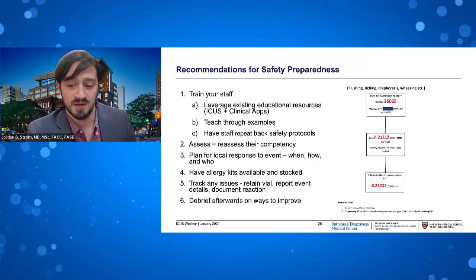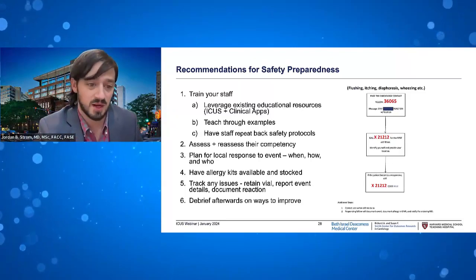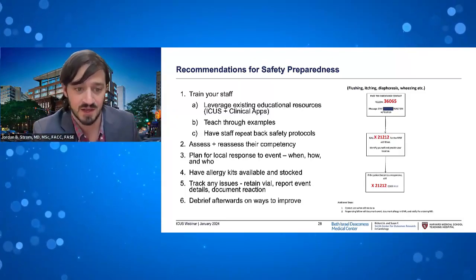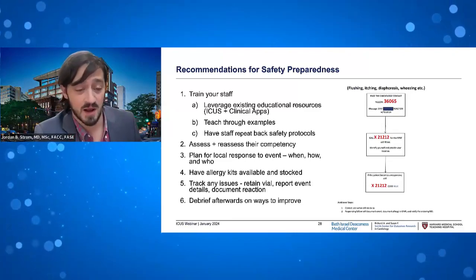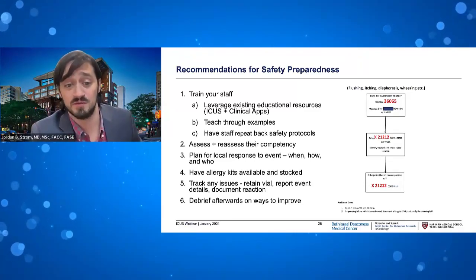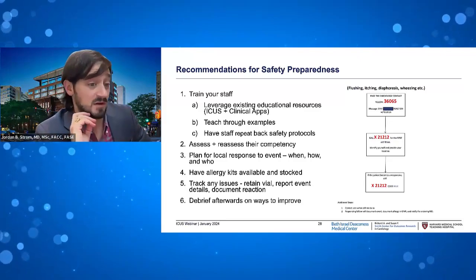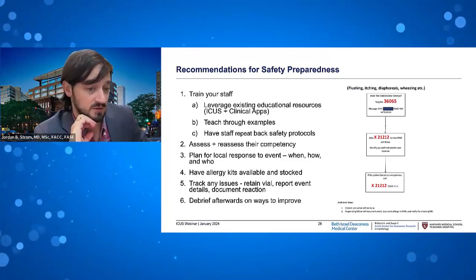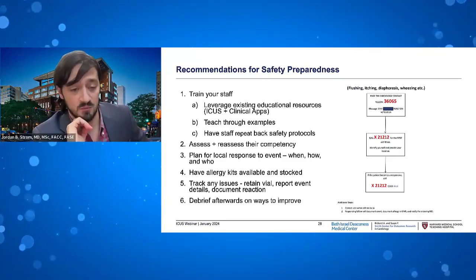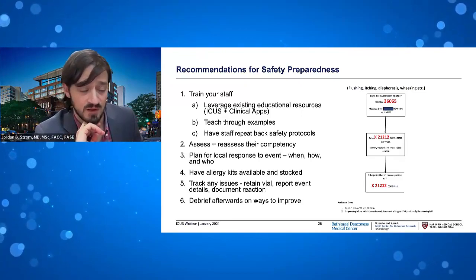And so if the patient became unresponsive, we would call code blue. But ultimately, that response mechanism in training and drilling it into the fellows, if you're not going to be there, if you have somebody covering, make sure they're covering the bubble pager and talk to them about what their expectations are, has worked out very well. And we have had reactions at our institution because we do use a lot of contrast. And those have gone well, and the patients have been safe, and ultimately a good outcome for everybody involved.